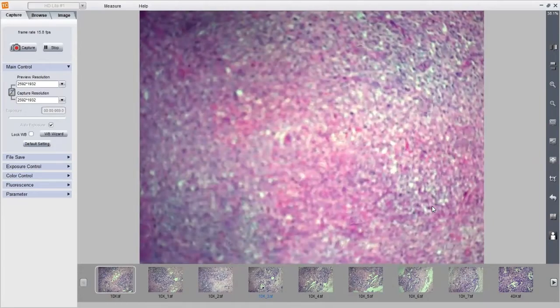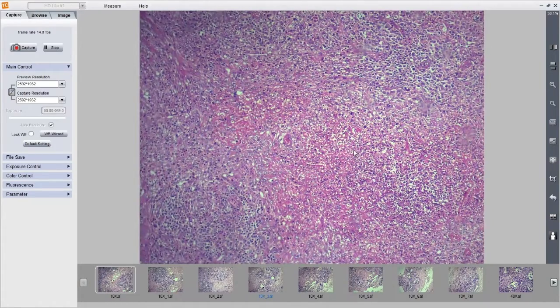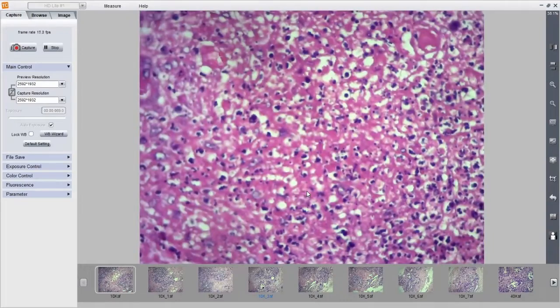What is this that you see here? Histiocytes? I'll show you in high power. Again, what is this? Apoptotic debris and necrosis. Yeah. So remember when I told you that lymphomas associated with necrosis are classic Hodgkin lymphoma. And usually around this necrosis is where you get a lot of Hodgkin cells, clustering of Hodgkin cells. So if you are finding it difficult to search for Hodgkin cells, always look around necrosis.